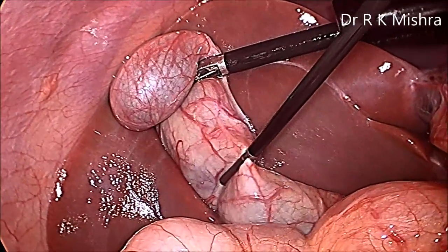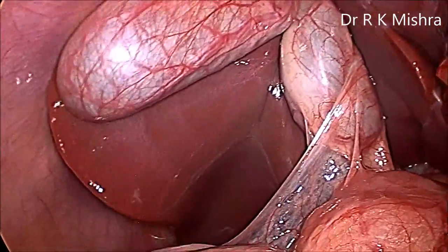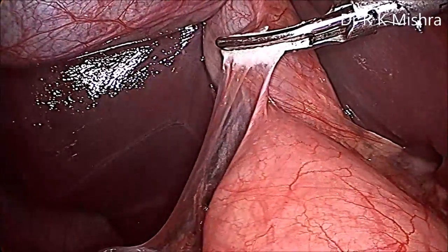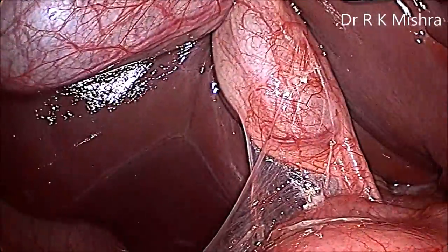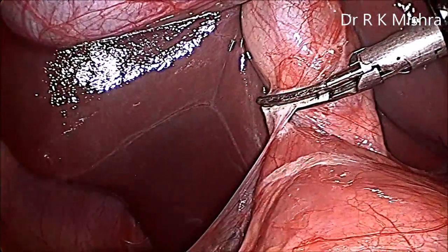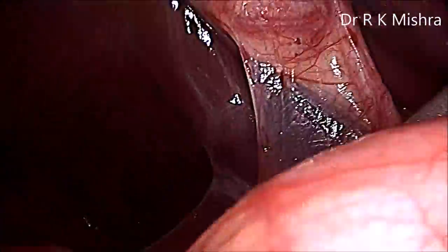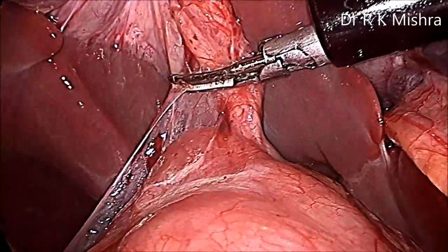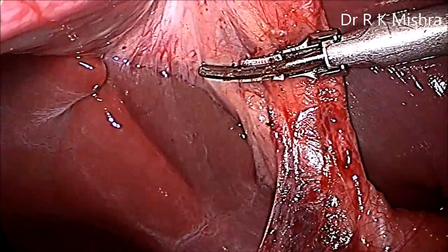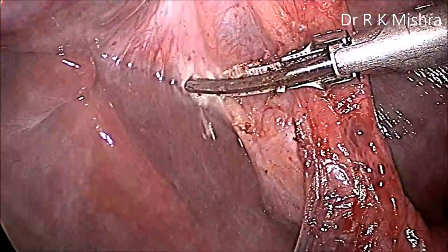The Striker mini alligator must control the gallbladder as well as the liver and retract it. It should not be held near Hartmann's pouch nor over the fundus. The Striker mini alligator is a 1.8 mm micro-instrument which does not leave any scar and does not need any trocar. There is a little adhesion; the duodenum is pushed down and some flimsy adhesions are separated. After that, the posterior peritoneum is dissected.